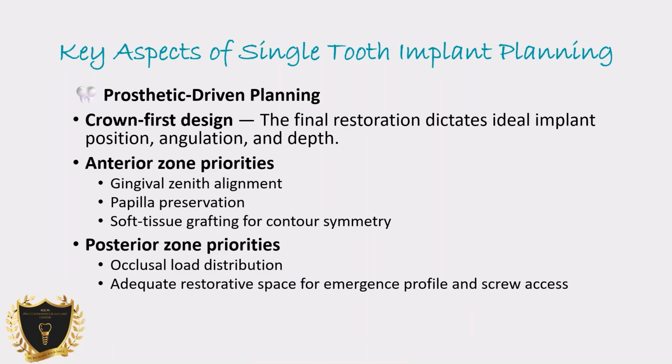The other day, I had a patient present to me who had implants placed by a provider 7 years ago, at both the 18 and 19 sites. There were 2 crowns. They were both loose with open contacts, and it had been loose for almost 6 months. She went for a cleaning, and the dentist said you need to see someone, and they referred her to me to evaluate.